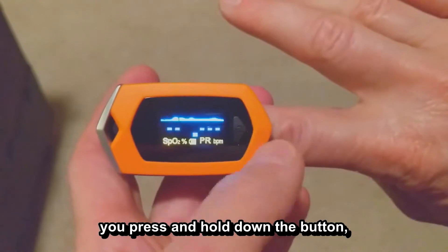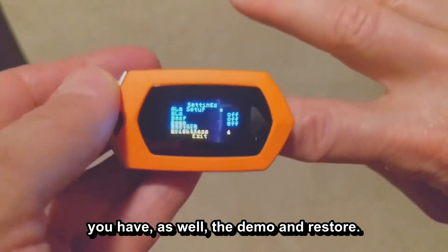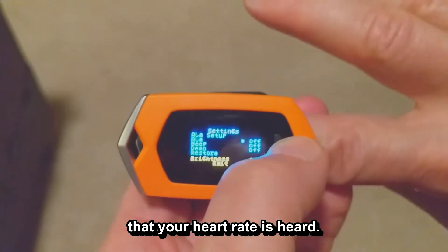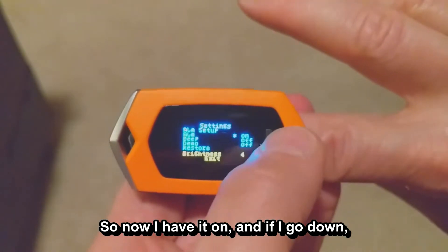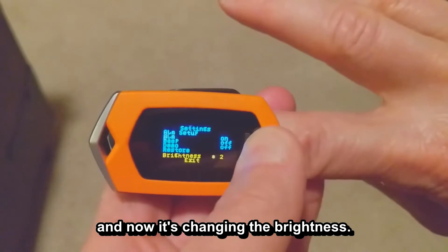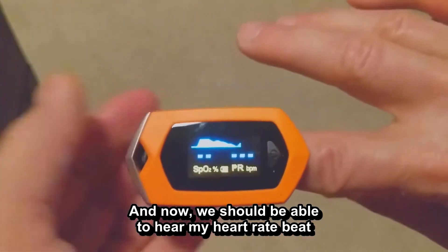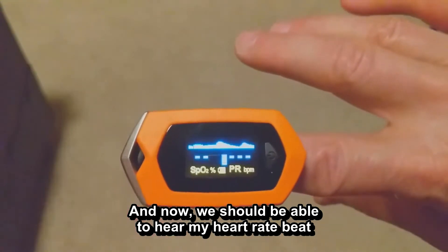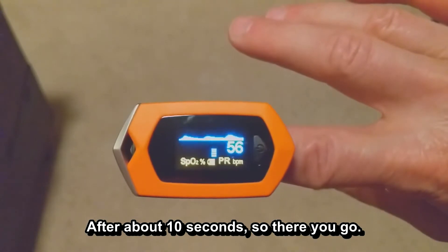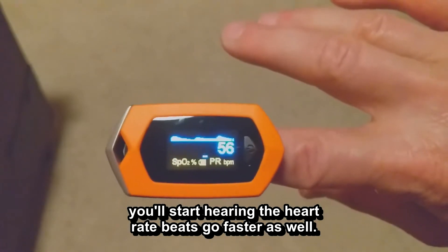If you want to go into the menu options, press and hold down the button, and it takes you into the settings screen. You have alarm, beeps, demo, and restore. If you turn the alarm on, it will beep every time your heartbeat is detected. You can also adjust the brightness while in that screen by pressing and holding the button — it will cycle through brightness levels. Press again to exit. Once out of the menu, you should be able to hear your heart rate as it makes beeping noises, and if your heart rate goes faster, the beeps will speed up too.